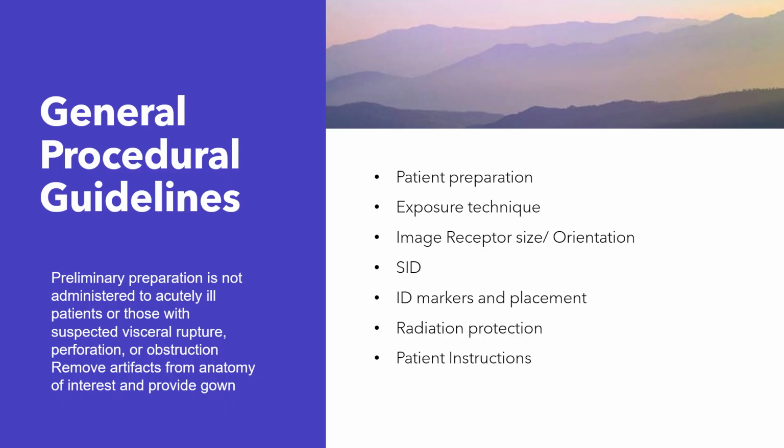You can advise the patient that the presence of their body decoration partially obscures the radiologist's view and affects the ability to make a definitive diagnosis, especially in the case of small cancer tumors. Tiny cancer tumors can be completely obscured by piercings.